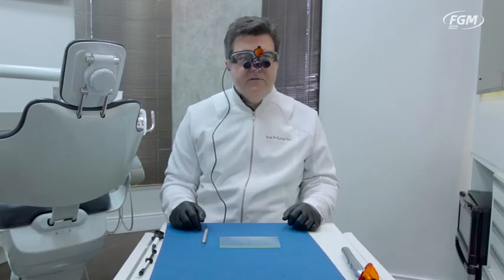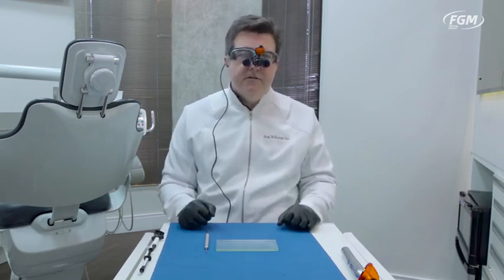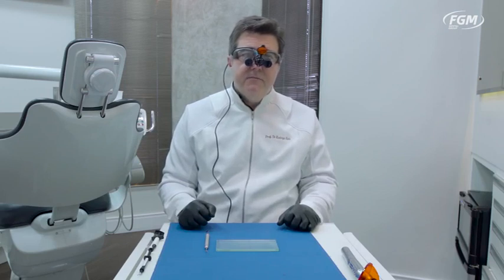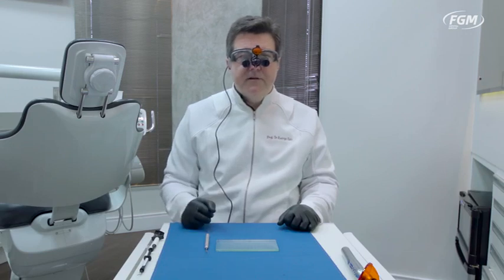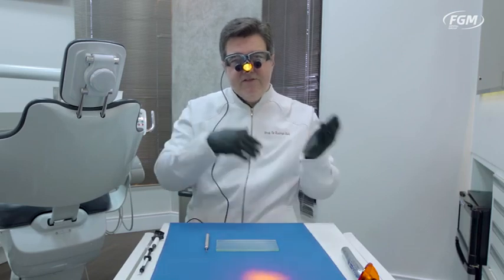Now we're going to demonstrate the effect of a well-illuminated operatory field without the amber-yellowish-orange filter on light-cured cements for veneers. It's extremely important to have long working time with veneer cement, because when you bond your veneers, you have extrusion of cement beyond the margins and you want to be able to get rid of the excess cement before light curing. If you're working without a filter or without a well-illuminated field, this might jeopardize your clear vision and you might leave more excess than you want. So I'm going to turn on my light and place the filter — in the office, you'd have to exchange gloves back and forth, wasting time and gloves.